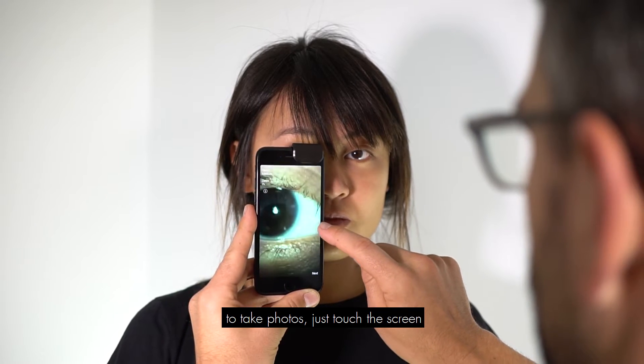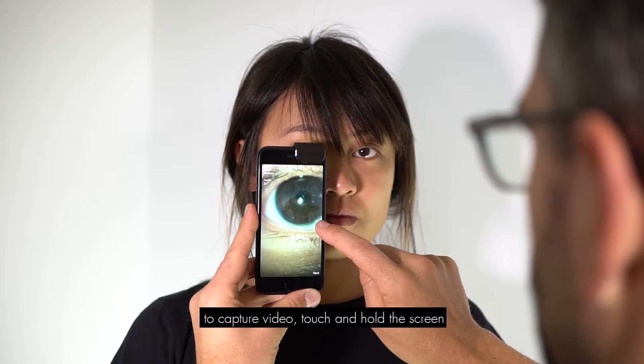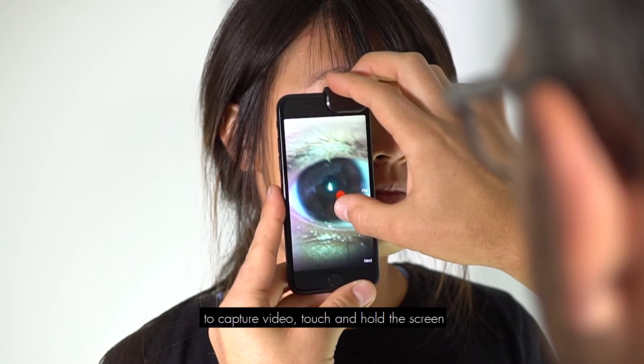To take photos, just touch the screen. To capture video, touch and hold the screen.